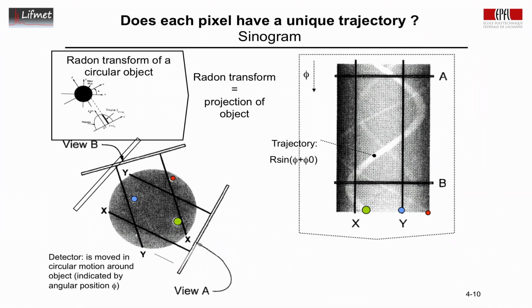And now you can think about it, that each point in my image is represented by a different maximum r. If they have the same r, then they will be differentiated by at which angle they have the maximum, that is where sine becomes maximal. That depends on when we are perpendicular to the position of that voxel. So this voxel has a maximum if the projection is here. The red one has a maximum here, pretty much at this orientation.